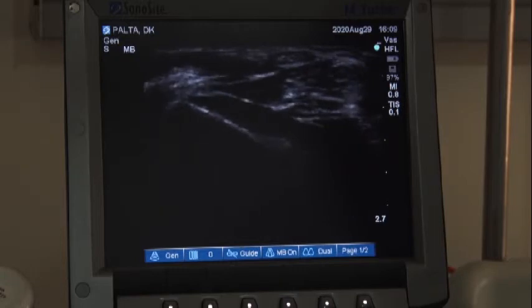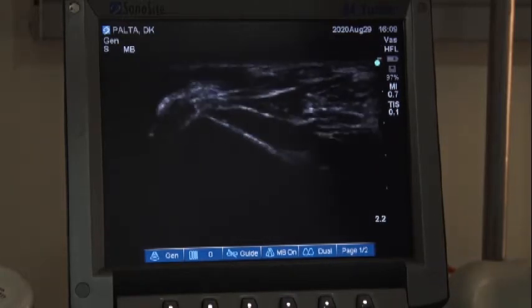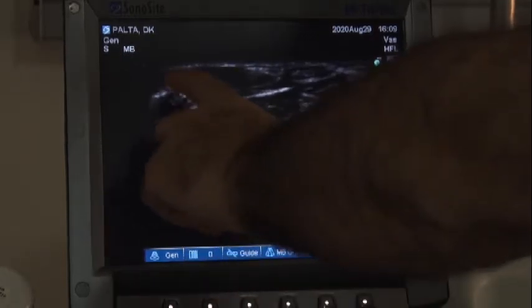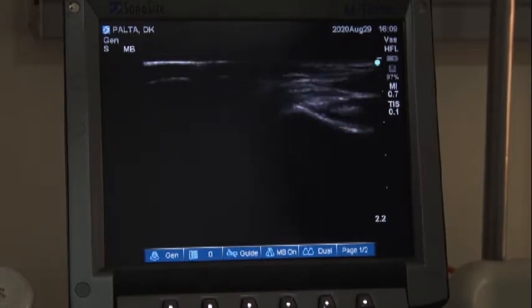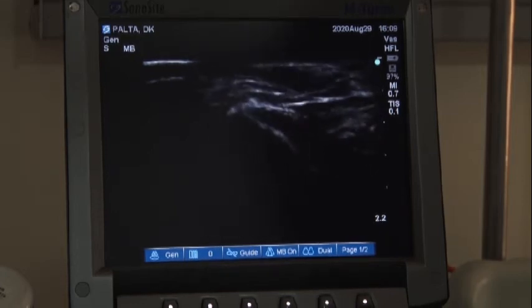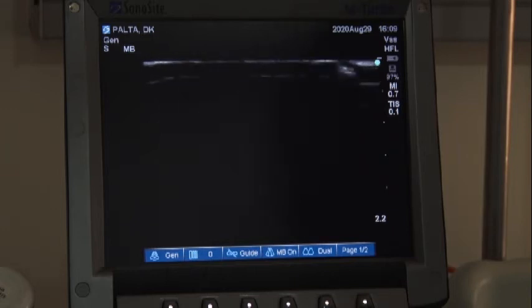See now, this is the anastomosis. Now you can see this is the radial artery. It's joined by the cephalic vein. I will make some adjustments to see it more clearly. I want to see the arteriotomy.